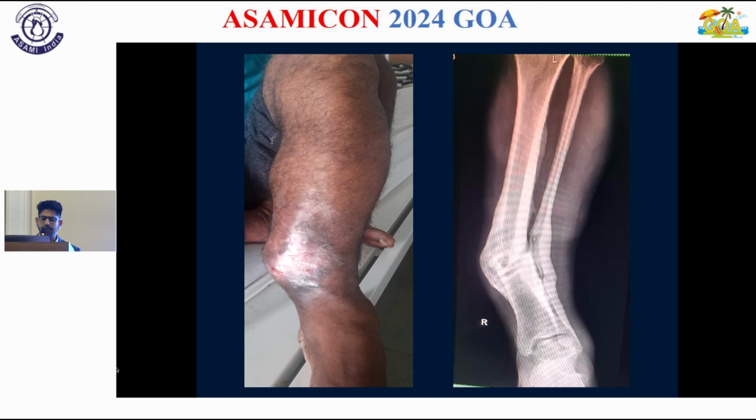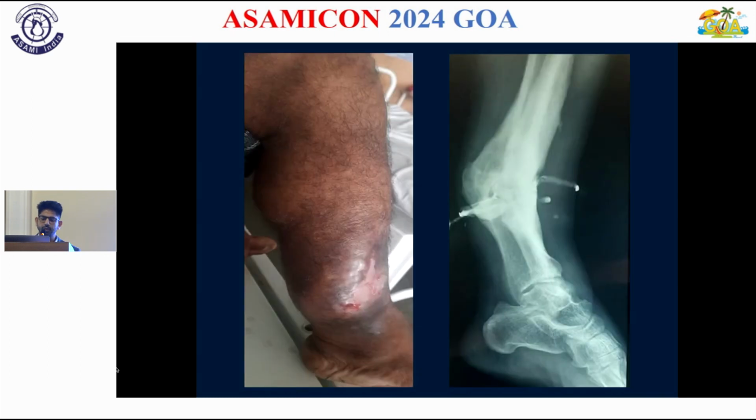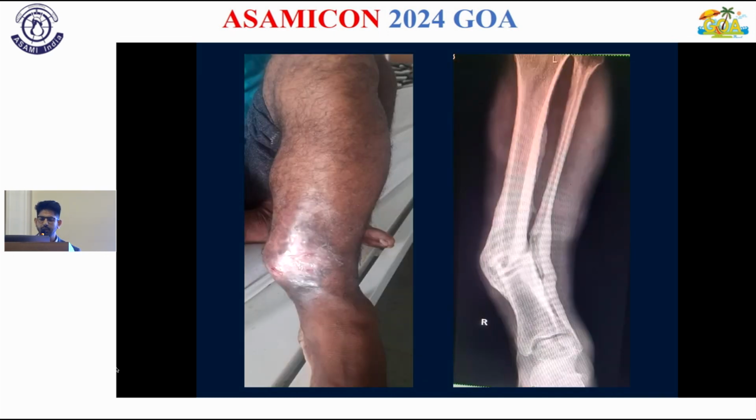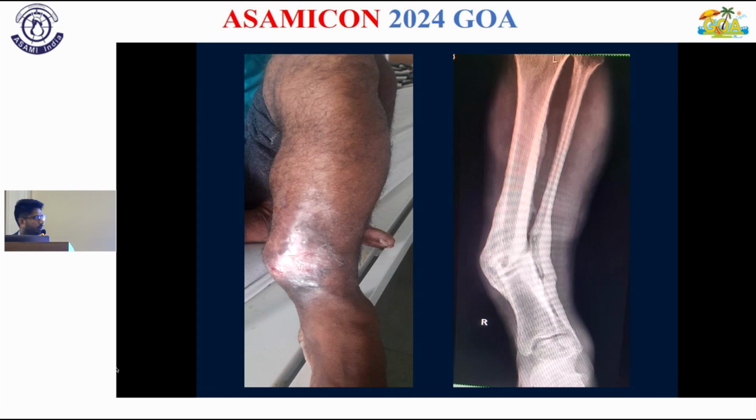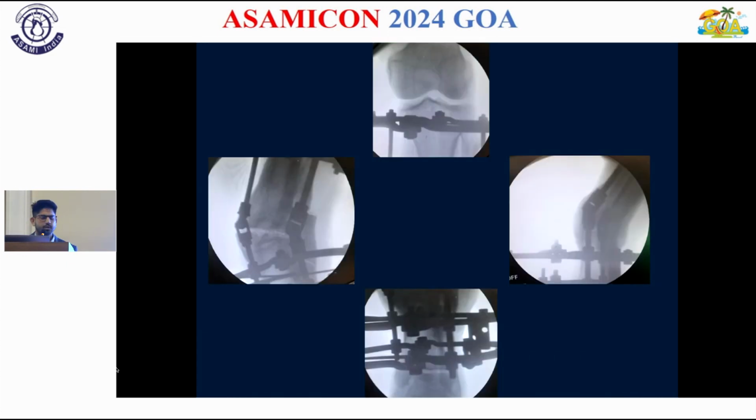This patient has a medial deformity, so the apex of the deformity would be somewhere on the posteromedial side. When you apply a fixator, you take the proximal ring in reference to the knee, the distal ring in reference to the ankle, and the hinge placement would be somewhat like that.